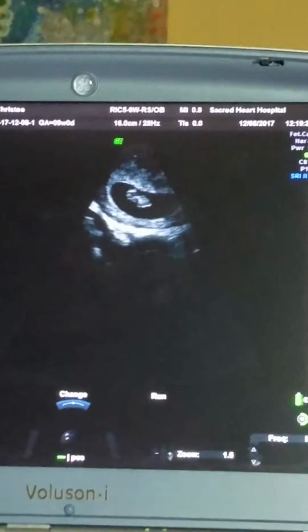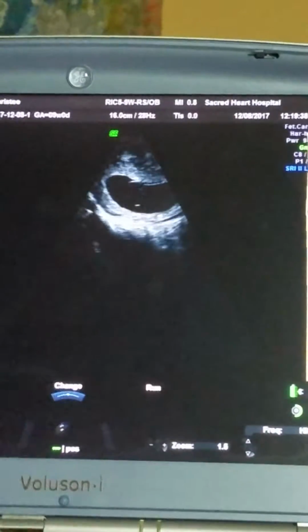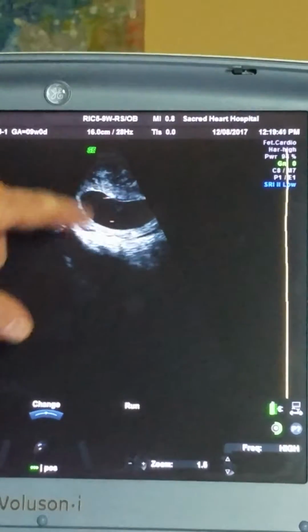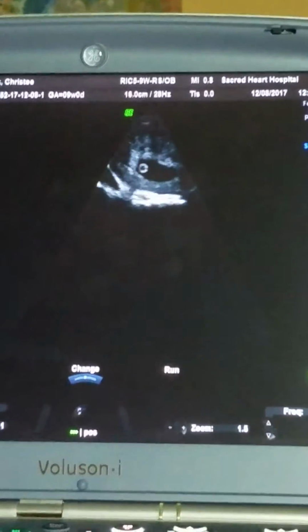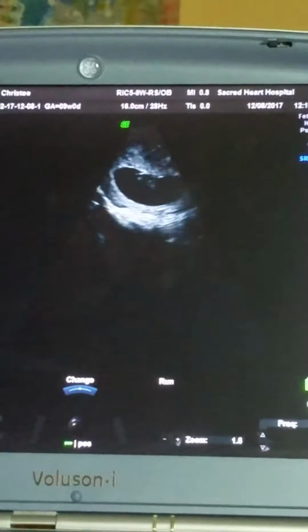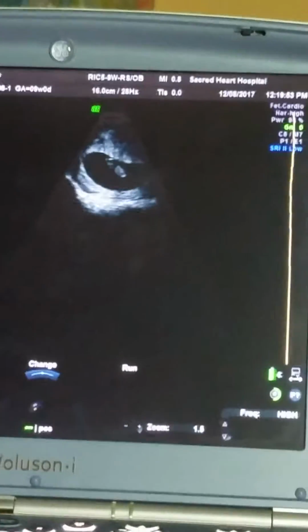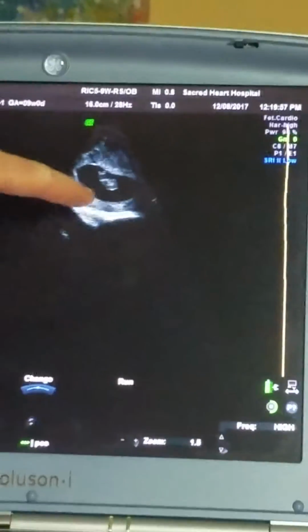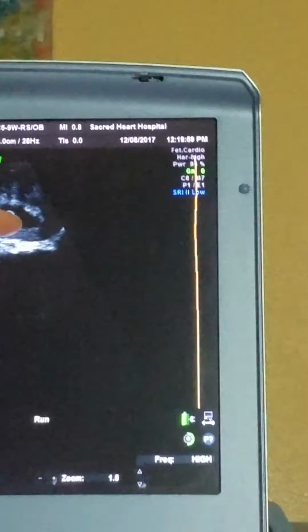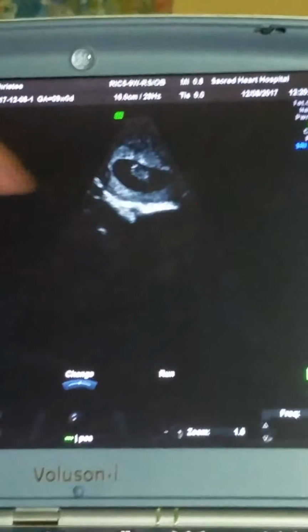And it's kind of cool to see it because one of the more amazing things about babies, you can see the little inside sac too. Yeah. So there's the inside sac that it's in, and then there's the yolk sac right there. So, and they live off the yolk sac until they get a placenta. So just like the chick and the egg, but when you're about 12 to 14 weeks, they'll start having that connection where you'll all of a sudden see something coming off them that goes to part of the outside sac where the placenta is going to be.